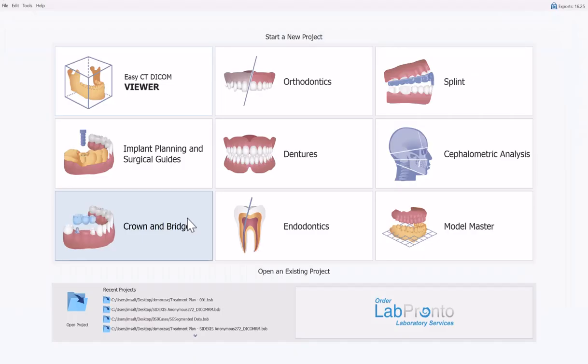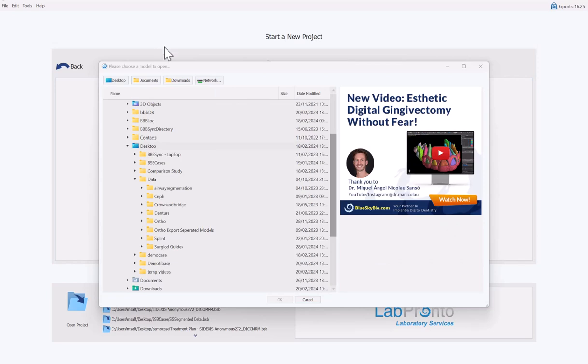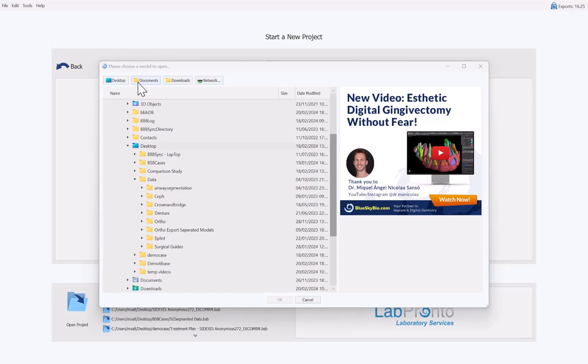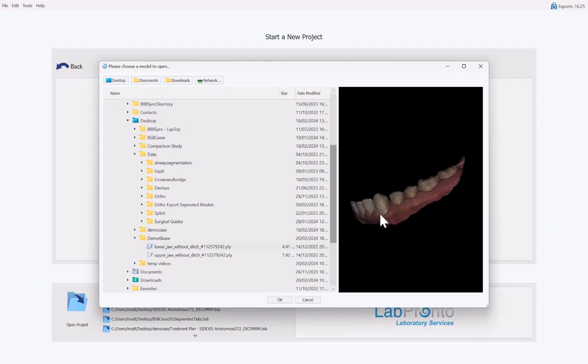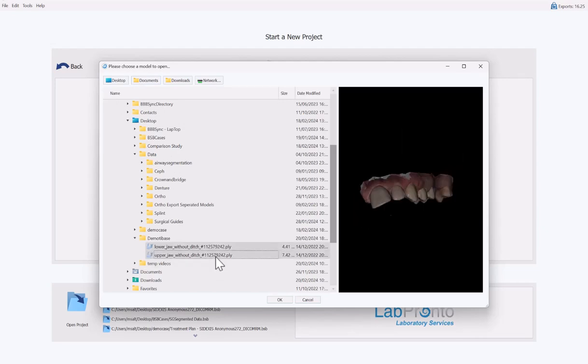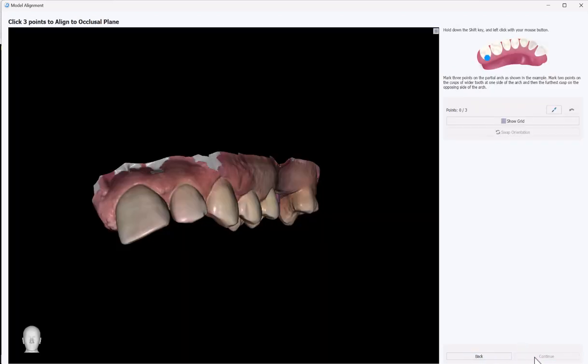We're going to start the process by clicking on crown and bridge, and then choosing crown for titanium base. Navigate to the location on your computer where you have the relevant files. We have the shortcut button going across the top for easy access. You can multi-select the relevant files by left-clicking on the first one and seeing a sample, and then hold down the shift key to multi-select several files. Once you've selected the relevant files, go ahead and click OK. We are now at the model alignment stage to properly align the models in space. Select the relevant jaw for which you'll be designing the restoration. Select the jaw type and select the model type. Click continue to alignment.